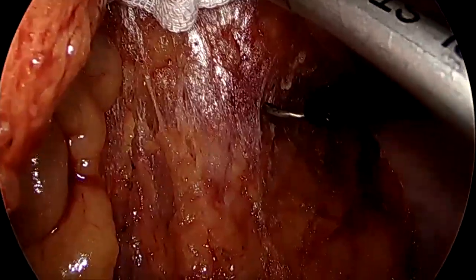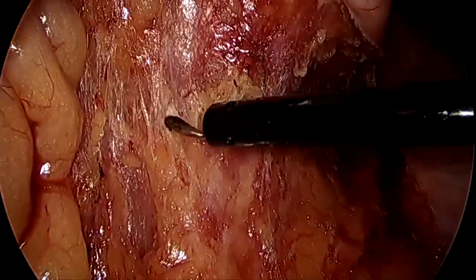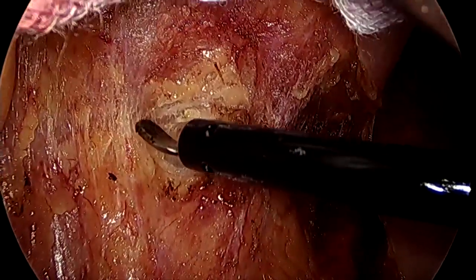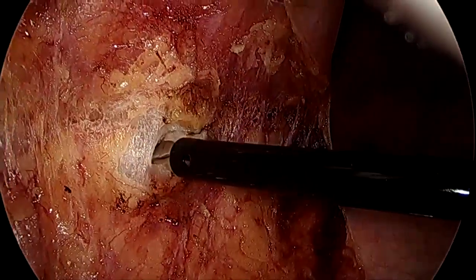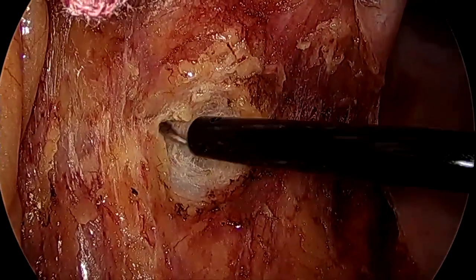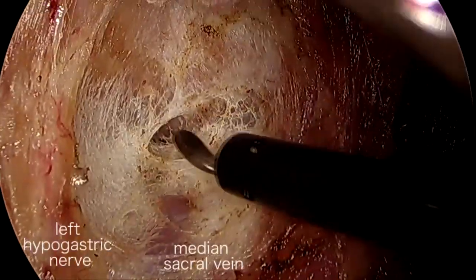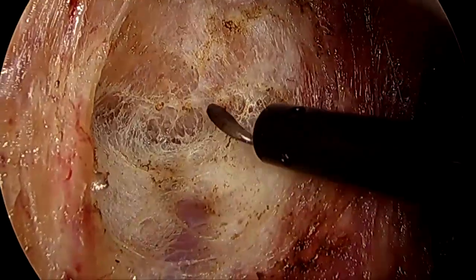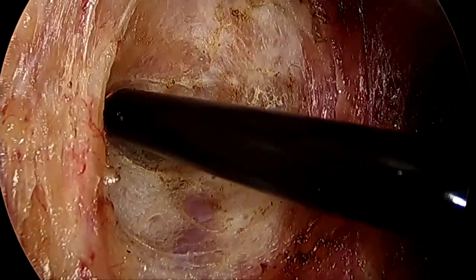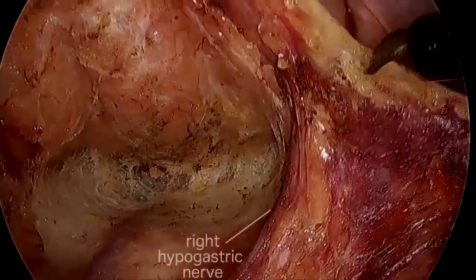Following the mobilization of the left-sided colon, posterior dissection of the rectum was continued until the pelvic floor was reached. During the posterior dissection, pushing up the posterior side of the rectum extended the loose fibrous layer. The right hypogastric nerve was preserved.